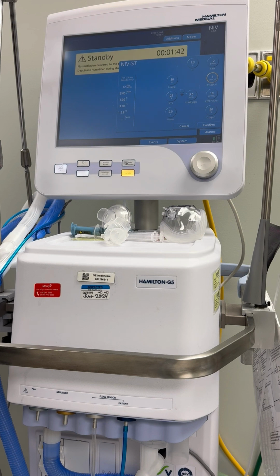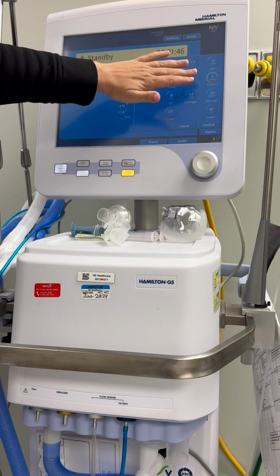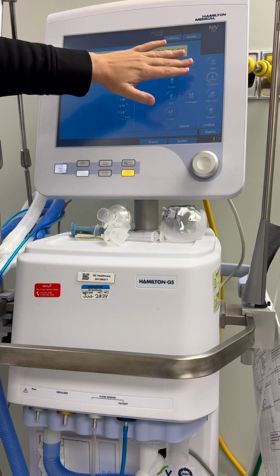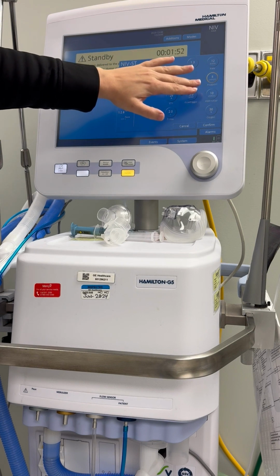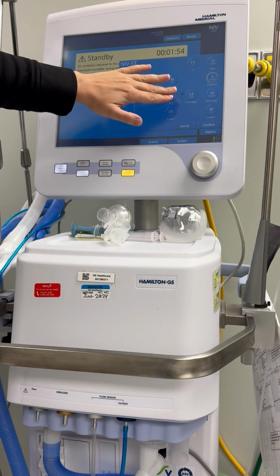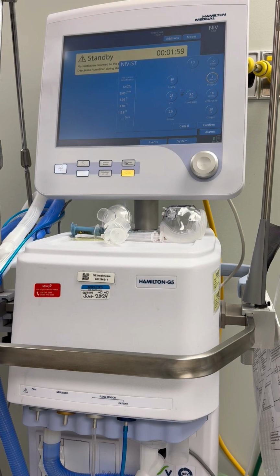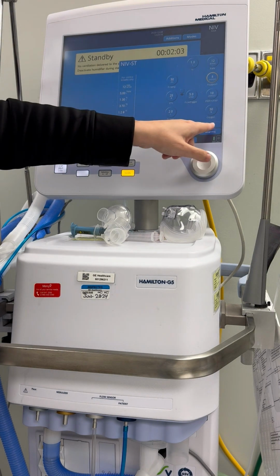Just keep it in mind. I know some people get a little confused and think that this is your IPAP setting, and it is not. It is your pressure support setting. So it would not be appropriate for you to set your patient up on 20 pressure support over 10. So just keep that in mind, that you are setting your delta P here. And you just increase it as needed for that patient. So we're going to hit confirm.